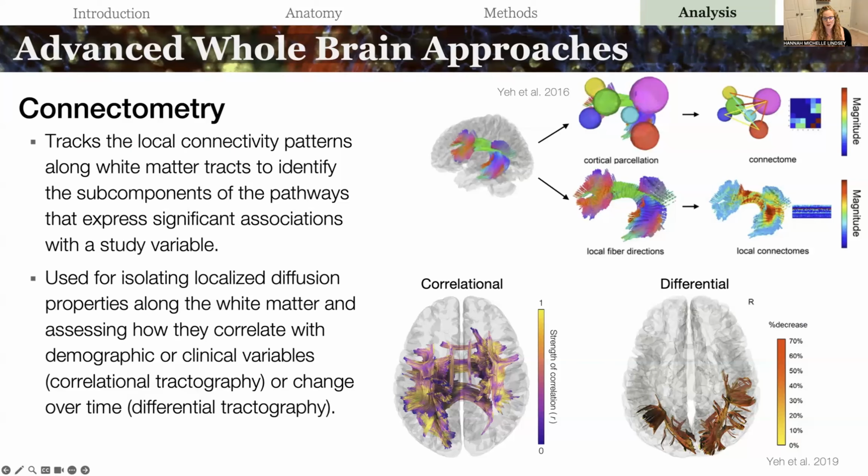Connectometry is very versatile and has enhanced sensitivity compared to conventional tractography, but it does require data reconstructed with GQI, and it relies on accurate streamline reconstruction. It's also pretty computationally heavy. Regardless, it remains invaluable for exploring group differences, clinical pathologies, treatment outcomes, and subclinical changes in relation to white matter integrity.